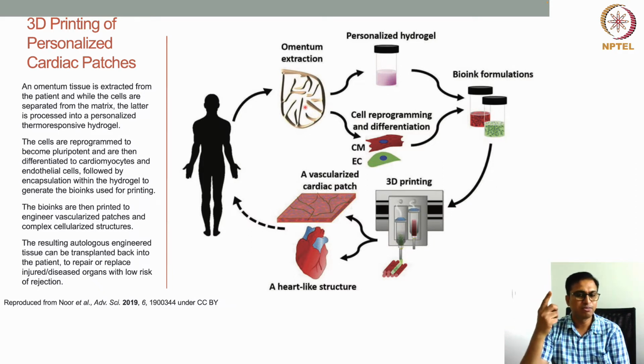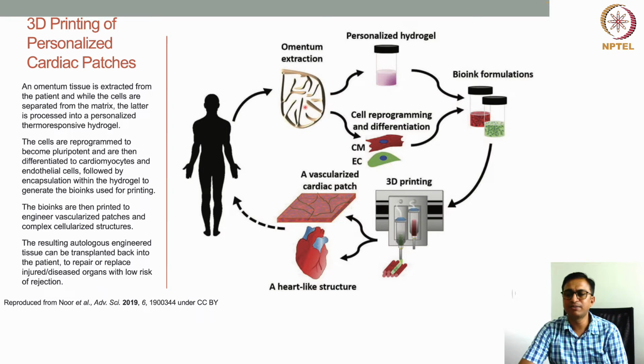The important thing here is that because this tissue is composed mostly of collagen and some other material, the collagen can go into the solution. For solubilization a lower pH is required, but the pH can be brought back to physiological pH, and at that time the hydrogel can form. If we incubate that at 37 degrees centigrade, then the collagen self assembly will start.